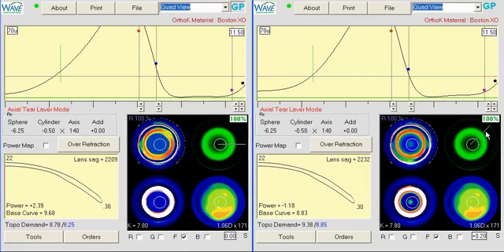The only thing I noticed is that your powers are, for example, -123 here, but in the vertical meridian we're about -90. So we can probably go through and make this a little bit more uniform. And so in 25% mode, because we are in free form, we're going to have to do this in 8 meridians. And so we'll start here, 123. That's a little bit closer.